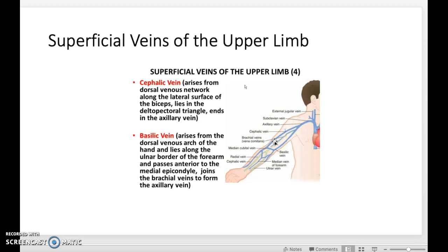IV sites too. People have used a jugular vein up here. People have also used the lower extremities like the feet. Those are for emergencies only. There's a danger of PEs, stagnant blood, and varicosities, and they're susceptible to trauma. So the CDC guidelines recommend that all cannulas inserted into lower extremities be removed as soon as an alternative site can be established.